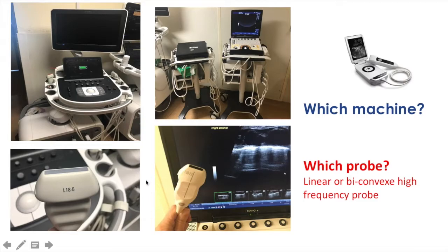Which machine should we use? Any machine. In our unit, we have the Philips machine with a long linear probe, L18.5, which we use for term babies. And we have 2 other portable GE machines as well, with a microlinear probe, L1022, which we use for preterm babies. But again, any probe, any machine can be used. You need 3 buttons: switch on button, depth and gain, and that's it.